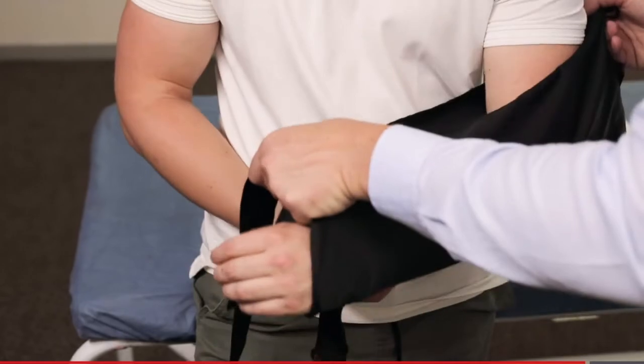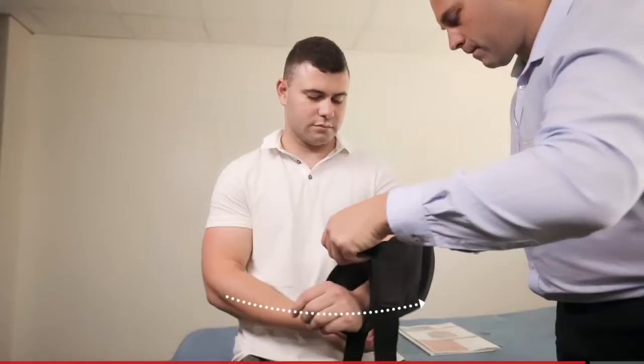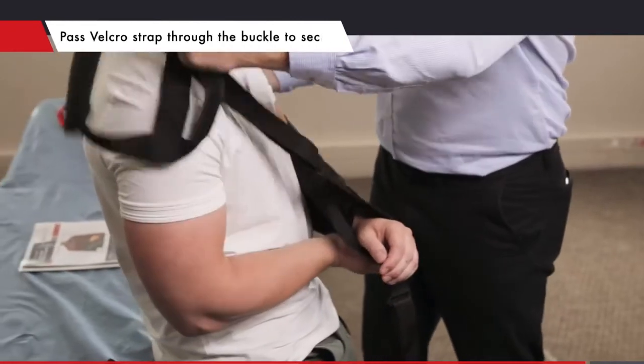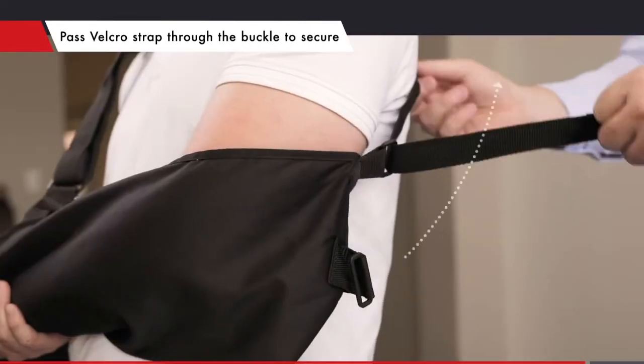Place the patient's forearm into the sling and position their elbow against the vertical seam of the sling. Pass the shoulder belt over the patient's shoulder and secure above their wrist.